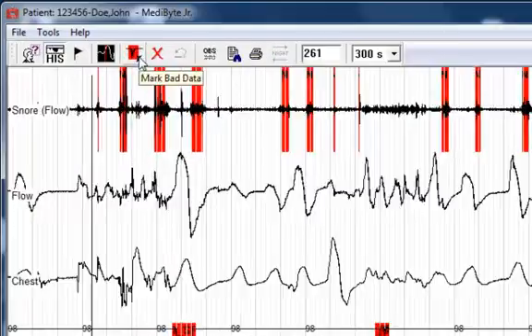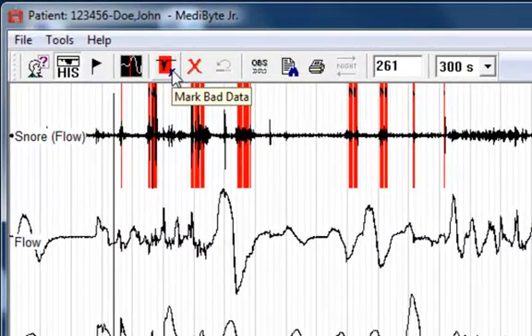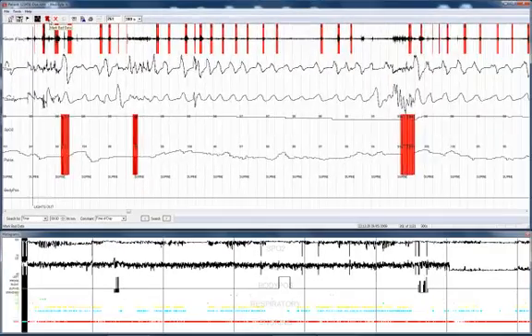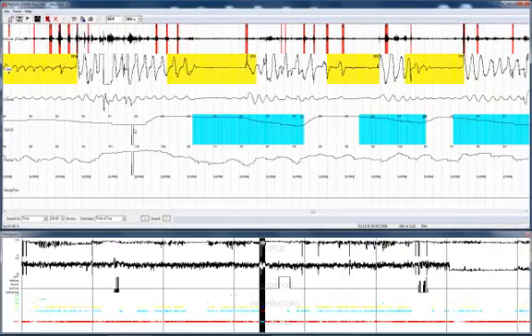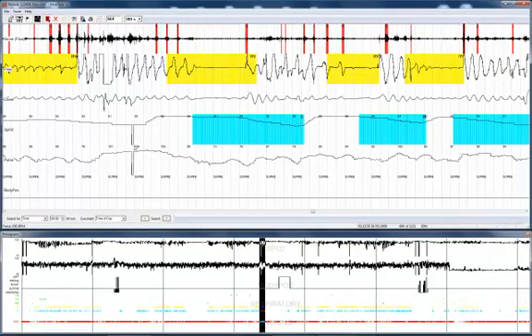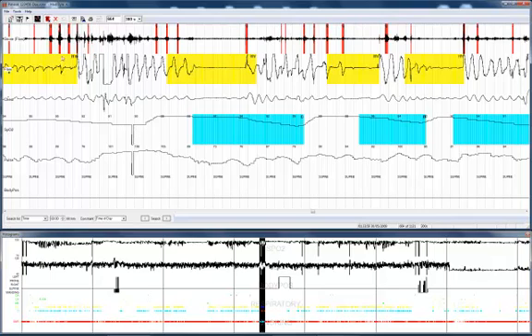The next toolbar icon we'll discuss is the mark bad data toolbar icon. What this shows you here is a drop in SpO2 based on an arousal at the end of a respiratory event.